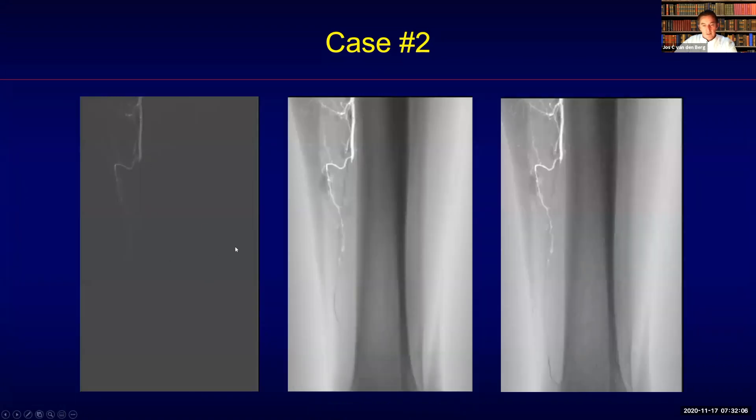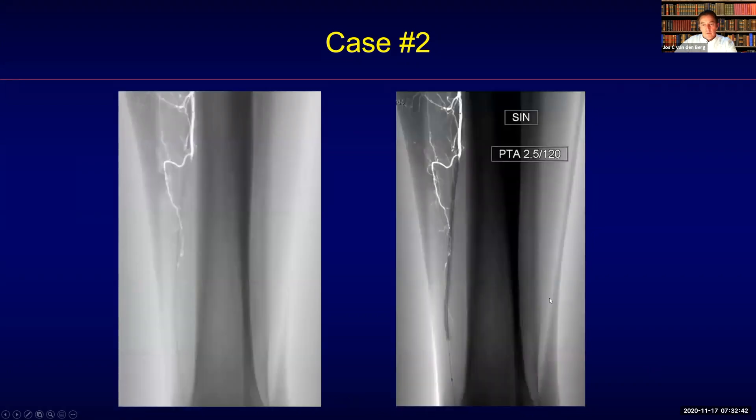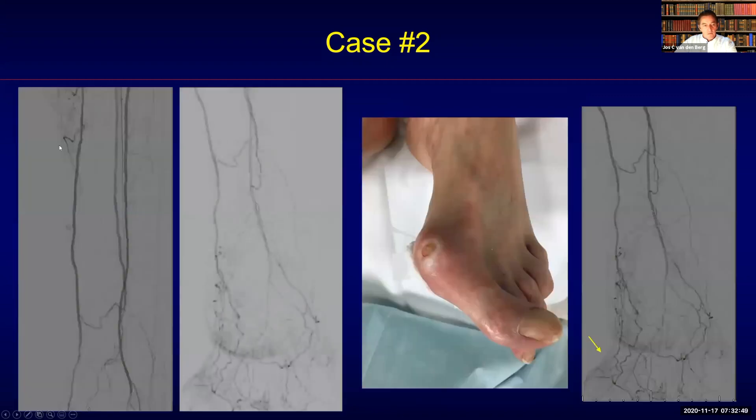Going for the posterior circulation first in an antegrade fashion, you can see the recanalization using selective angiography with a selective roadmap going all the way down. It was necessary to pre-dilate this very tight occlusion from distal to proximal with the Armada XT, a short balloon starting distal first to cross with the lowest profile towards the distality, then pull back the balloon after inflation and follow up with a 2.5-120 as final therapy delivery. You can now see reconstitution of antegrade flow towards the posterior circulation with some collaterals and an improvement of the wound blush.